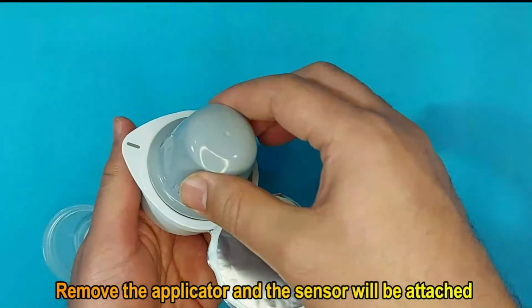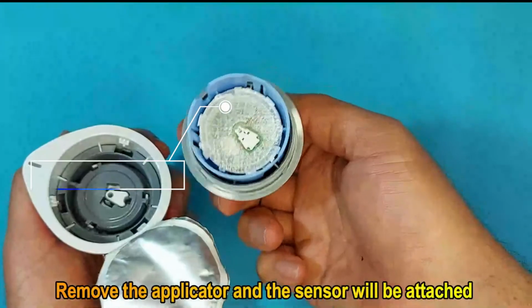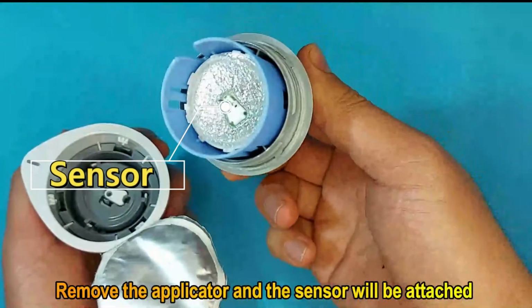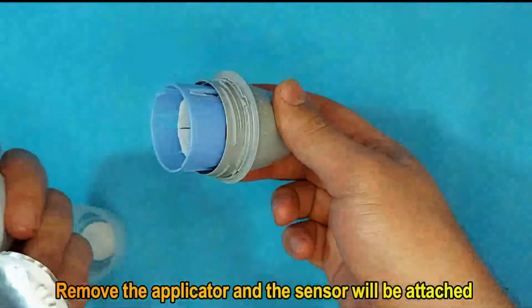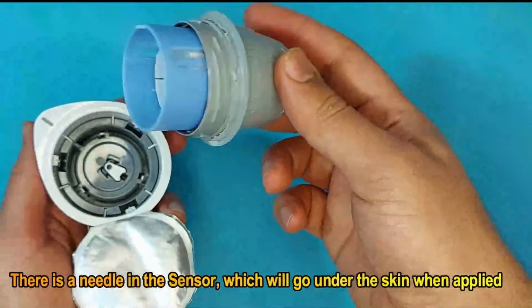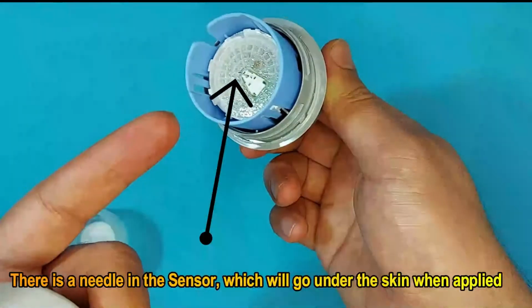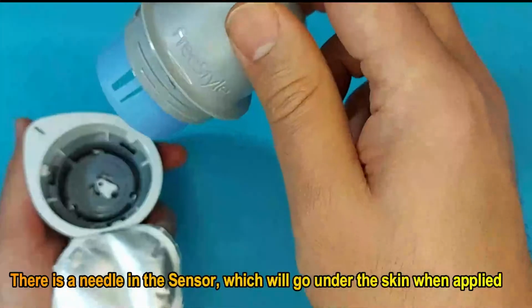Now remove the applicator and the sensor will be attached to the applicator. As you can see, this is the sensor pack which is attached to the applicator. That is the sensor, as you can see in this video. There is a needle in the sensor which will go under the skin when applied.